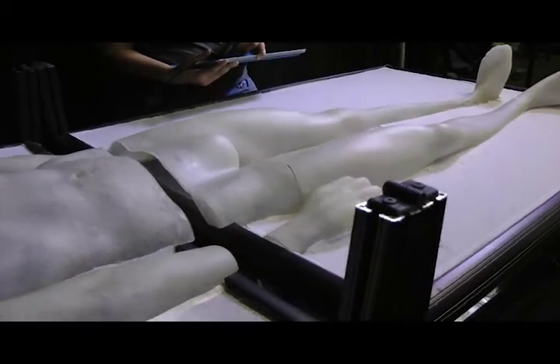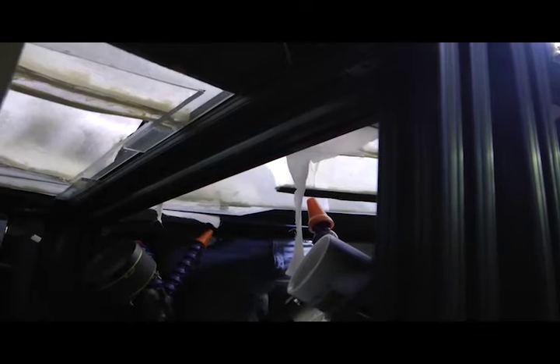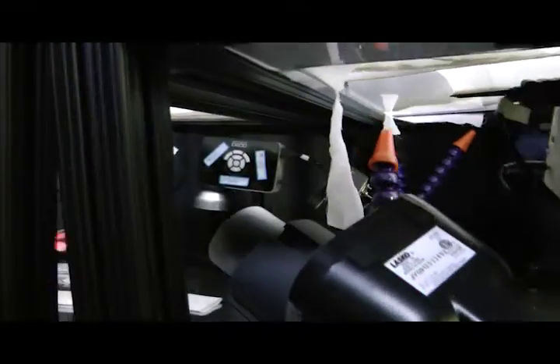To control temperature, a series of heat fans and tubes are installed under the virtual patient, which can distribute warm air to any portion of the body, allowing variations in body temperature. This system is controlled through a series of relays interfaced through USB, one of which controls fan power while the other controls the heating element.